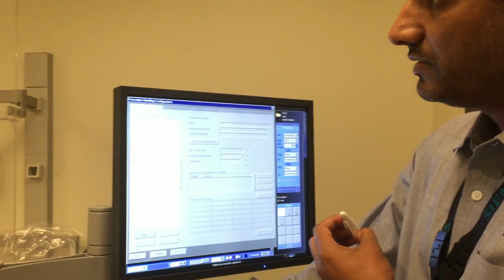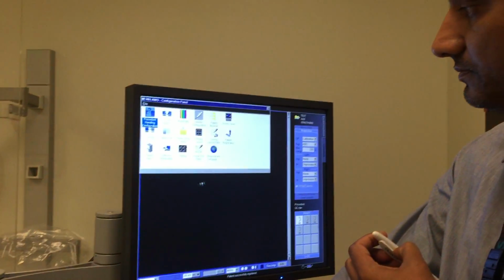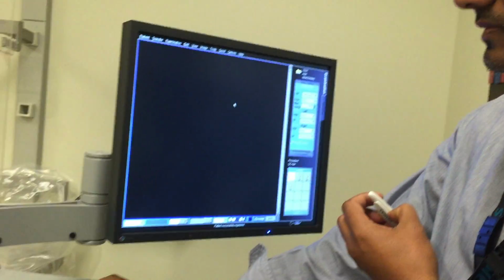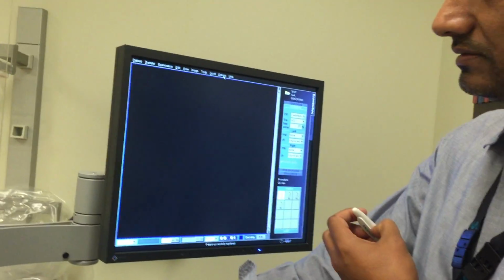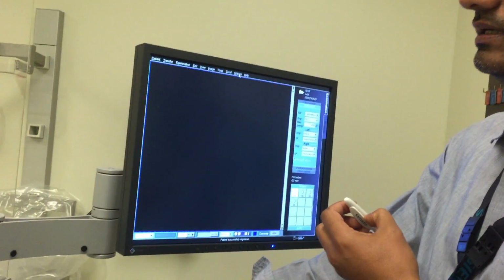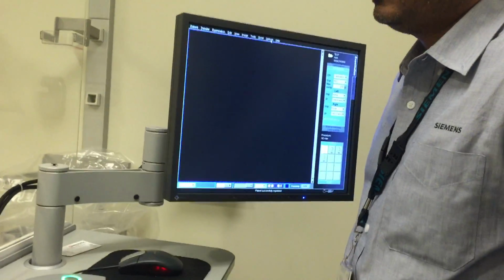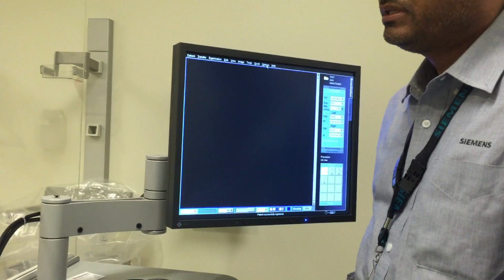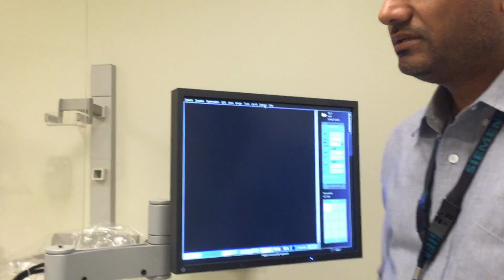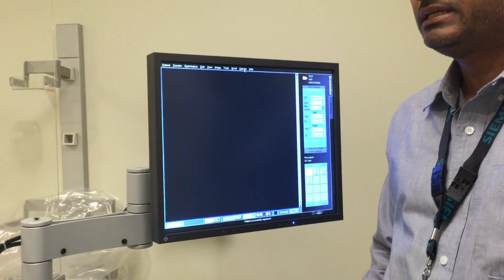Let me ask you, if the technologist comes in here on Monday, can she access this procedure handling? Yes, she can access. She can add additional types of exams. She can, but usually all are pre-programmed during the installation. So she doesn't have to come in every day and change settings or create new protocols.